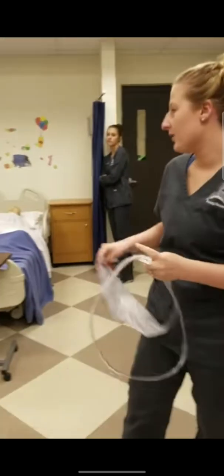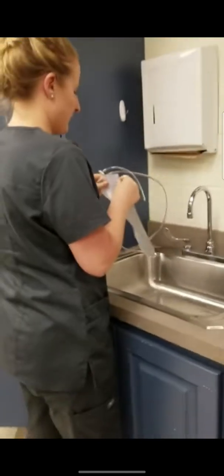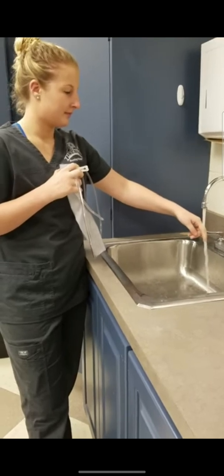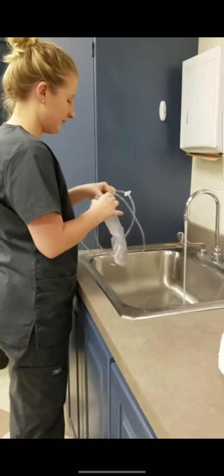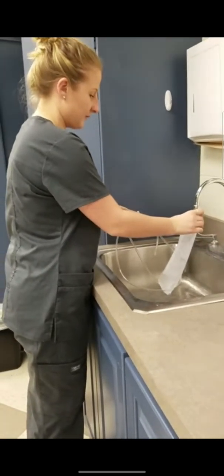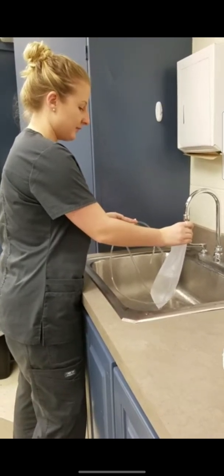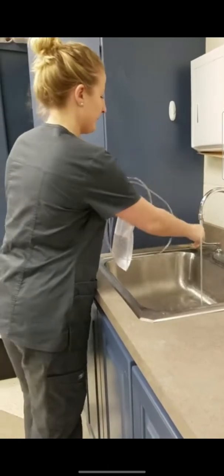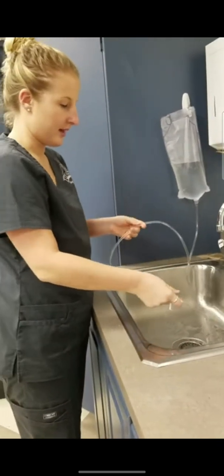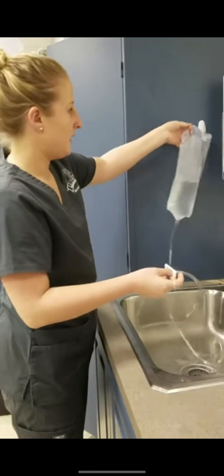I'm going to make sure that I have all my supplies gathered. I'm going to fill up my enema bag to between 500 and 1,000 mLs and get started. I'm going to use lukewarm water, not too hot and not too cold. After I fill up my bag, I'm going to hang it on a clip and unclamp it to prime my tubing to make sure there's no air in there. Then I'm going to clamp it back and take it into my room.